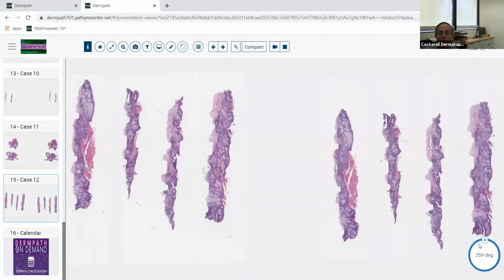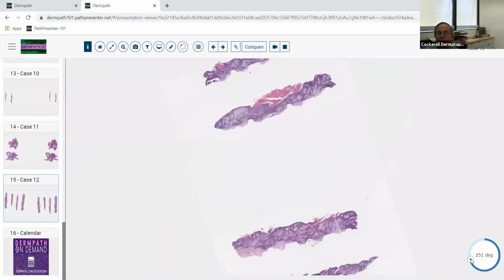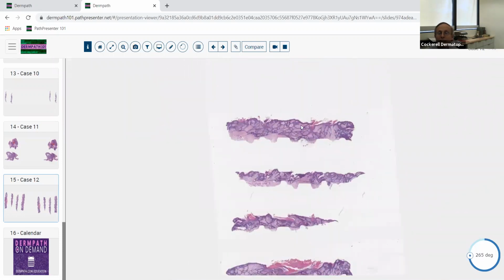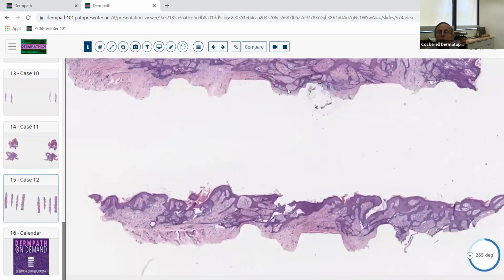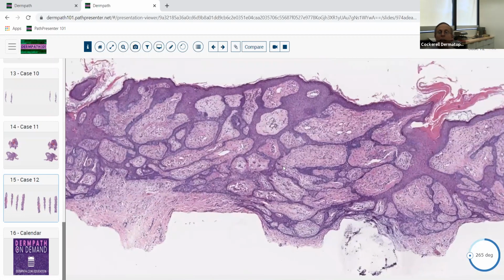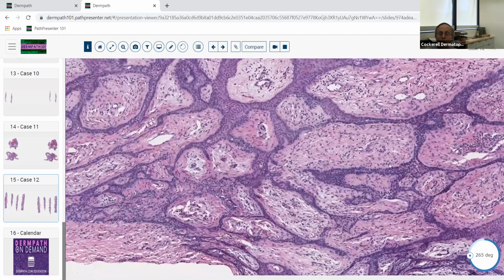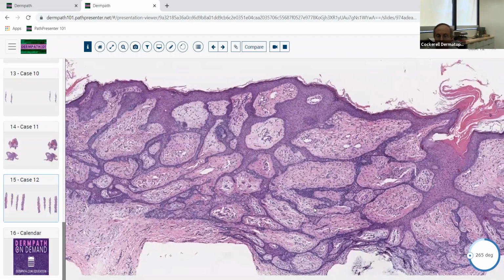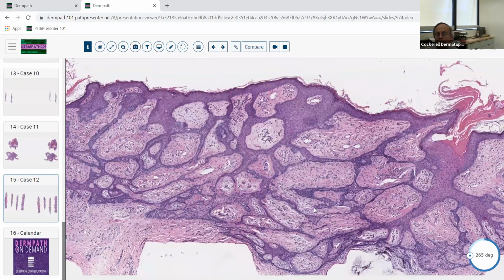Okay, the last lesion we're going to look at today is another example of a variant of a basal cell carcinoma. Here we've got this reticulated basaloid proliferation that's oriented in a horizontal plate-like fashion and is contiguous with the epidermis. You've got these individual little aggregations of basaloid cells and a prominent fibrous stroma with a lot of fibroblasts and mucin. This is what we call a fibroepithelial tumor of Pinkus. It's a variant of a basal cell carcinoma.